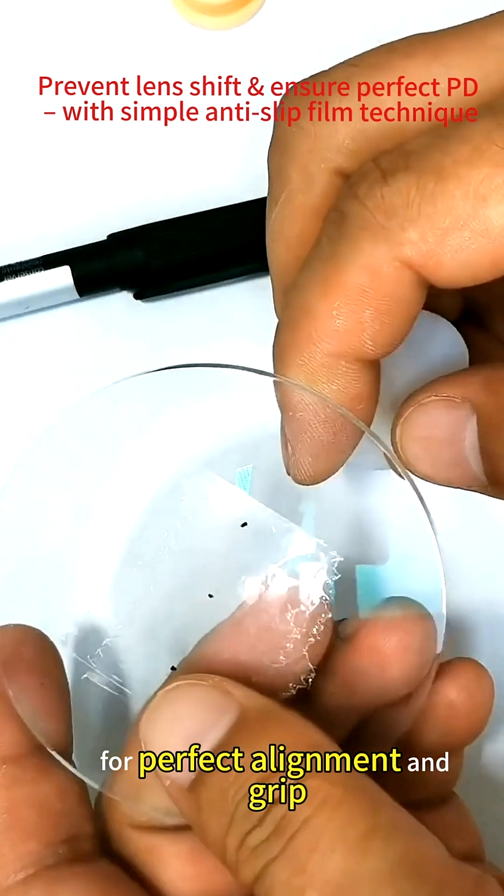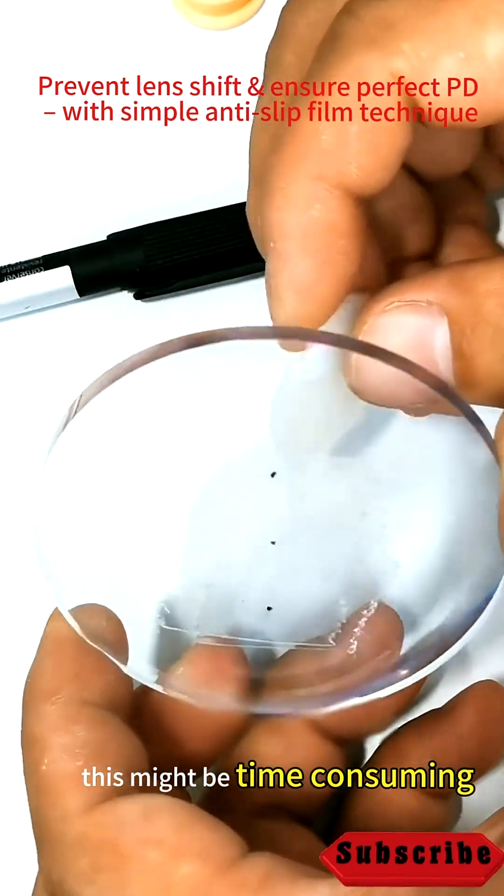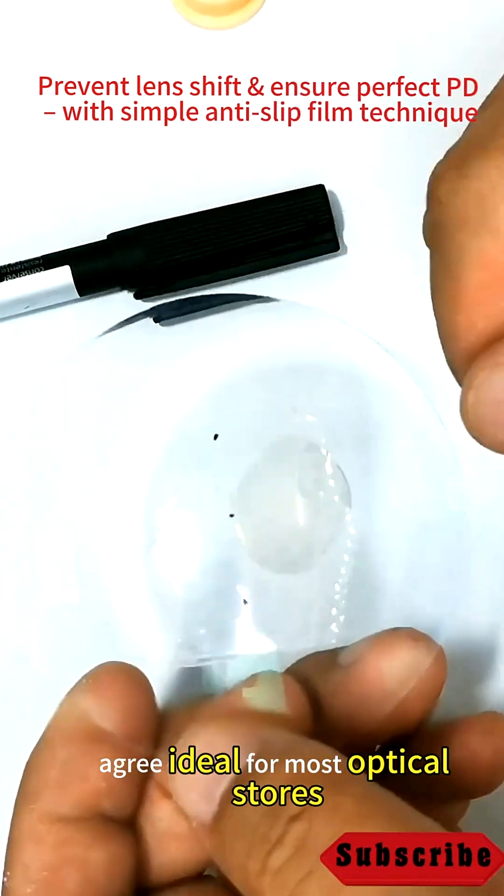For perfect alignment and grip, extra care is needed. If you are mass-producing glasses, this process might be time-consuming — but it's ideal for most optical stores.